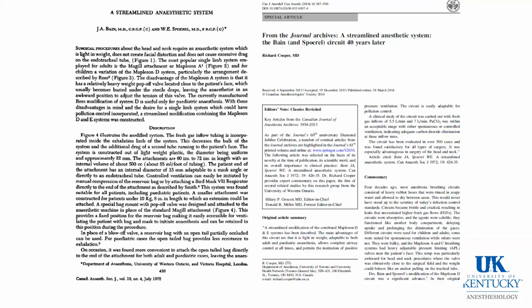So, in conclusion, it appears as if the modified Mapleson-D Bain circuit is in use in the United Kingdom, perhaps mainly in anesthesia induction rooms, and it does appear to be sold in Asia.